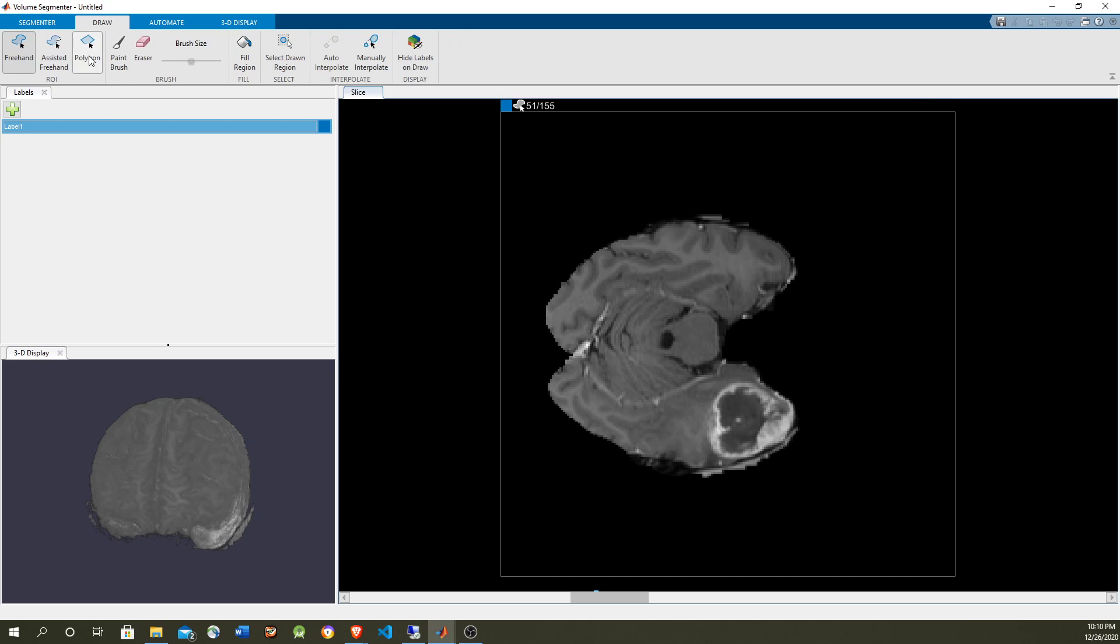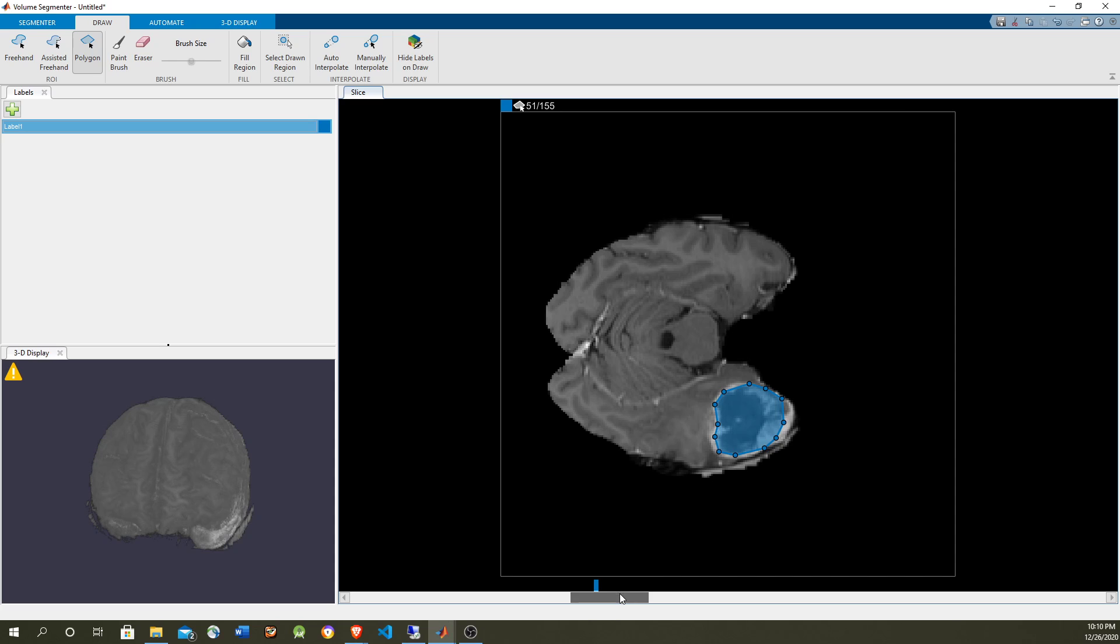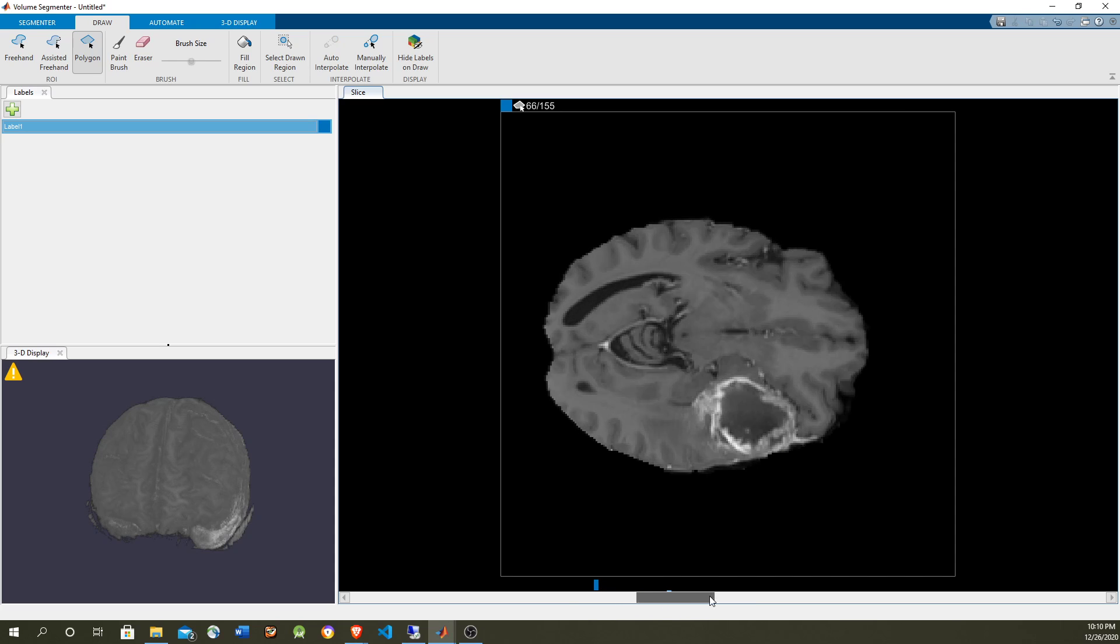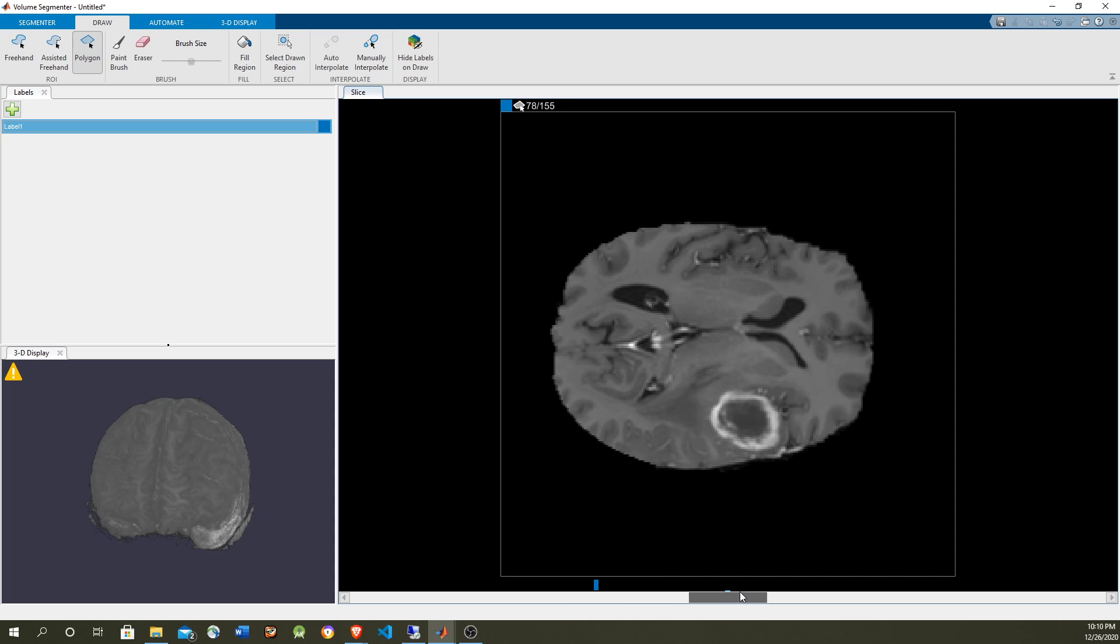So here I'm going to draw a polygon, which works similar to marking distances, measuring distances in Google Maps. And now let's take the final about when the tumor is about to disappear.